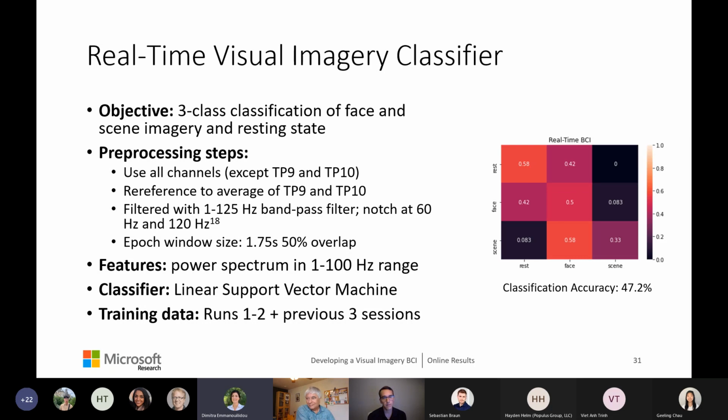One of the issues you mentioned is that, as a principal investigator, you wish you could have more data recorded, but as a participant, at times it may get a little bit painful, so you couldn't leave the device on your head for long periods at a time. Is there anything else that you may have observed from these two sides of this project regarding the stimuli, perhaps?